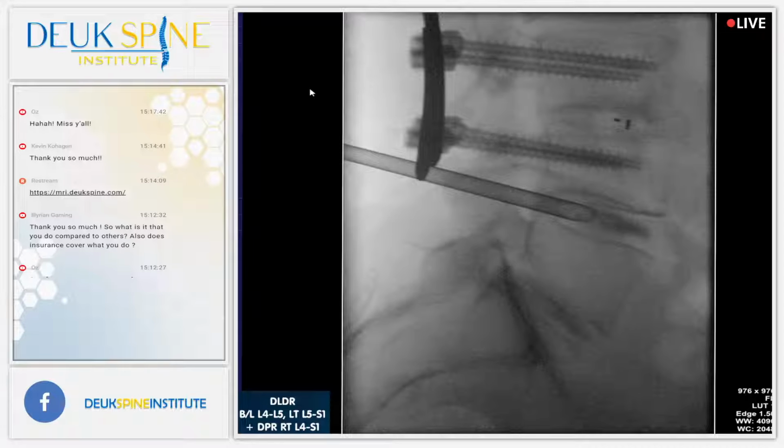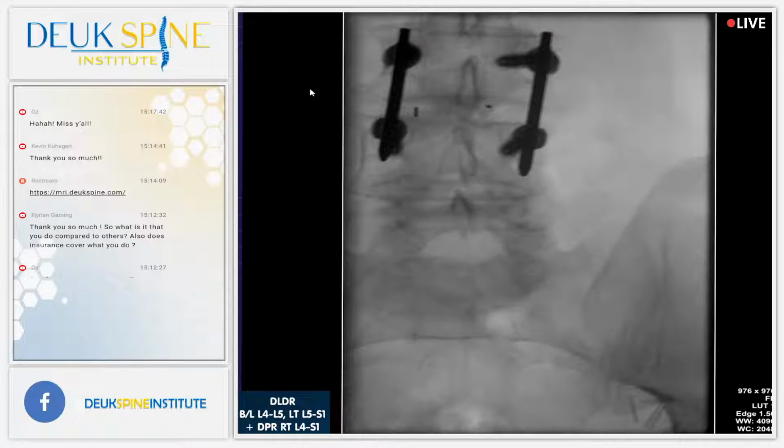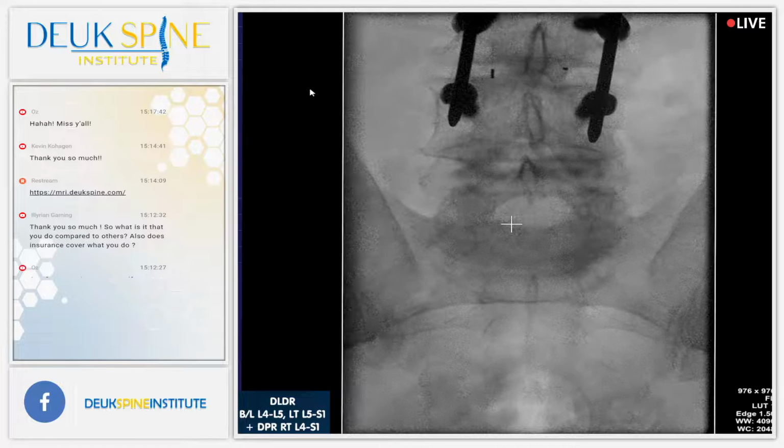Take your time. Let me know when you're ready, Luis. And let's get one quick AP. Move your hands. All right, beautiful. Now, just give me a second. All right, so we've got that bottom screw. So that's a 3-4 fusion. So that bottom screw is at 4, right? Everyone agree? So you can see everything nicely. You don't really have to move very much. Let's see what you did. Sean? Yeah, I wouldn't do that. Go back to where you were. Actually, you had it all nice. Now, don't tell me you're going to have that X cross there, right?